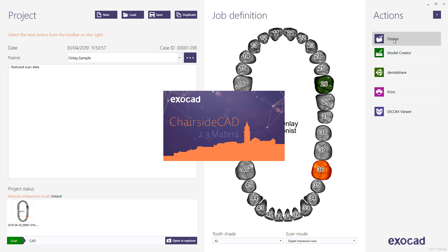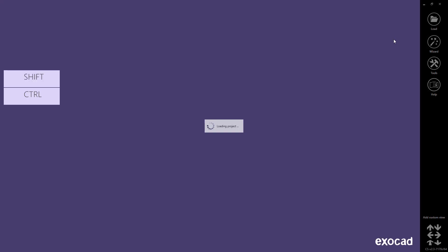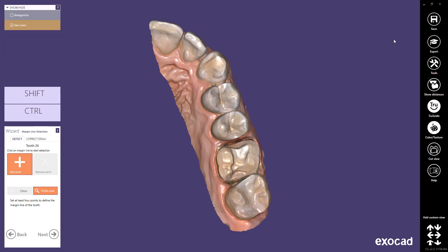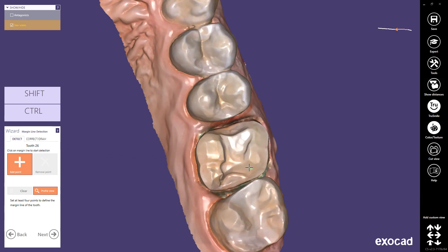The software automatically starts a wizard that will guide you through all the work steps. The wizard will prompt you to click on the margin for a specific die or tooth. It is important to start with the tooth displayed in the wizard. To start the design, click to define points of the margin line in the detect mode. This will allow you to use the margin line automatic detection.